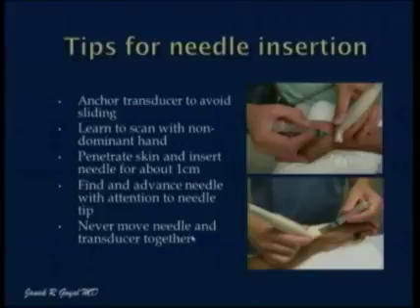Find the needle and pay careful attention to the needle tip. Please do not advance the needle if you do not see the needle tip. And never try to move both needle and transducer together. You will never find the needle.